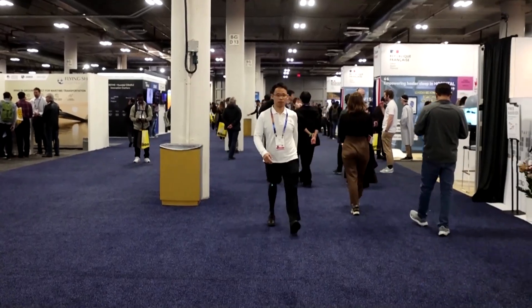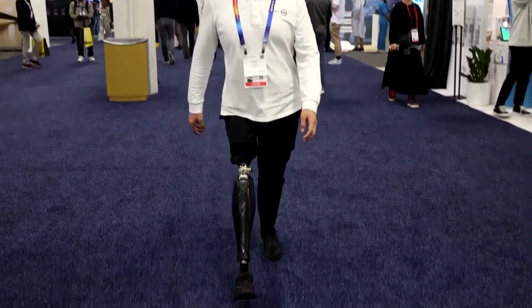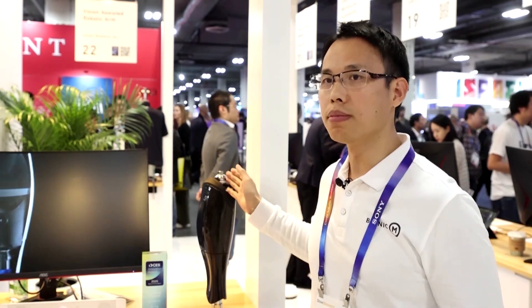BioLeg CEO Sun Xiaojun explains how. So it's totally different from current products available. Current products on the market are passive, which means it's only bone and joint without muscle. You can imagine what will happen if you're losing muscle. This one has muscle. That makes a big difference.